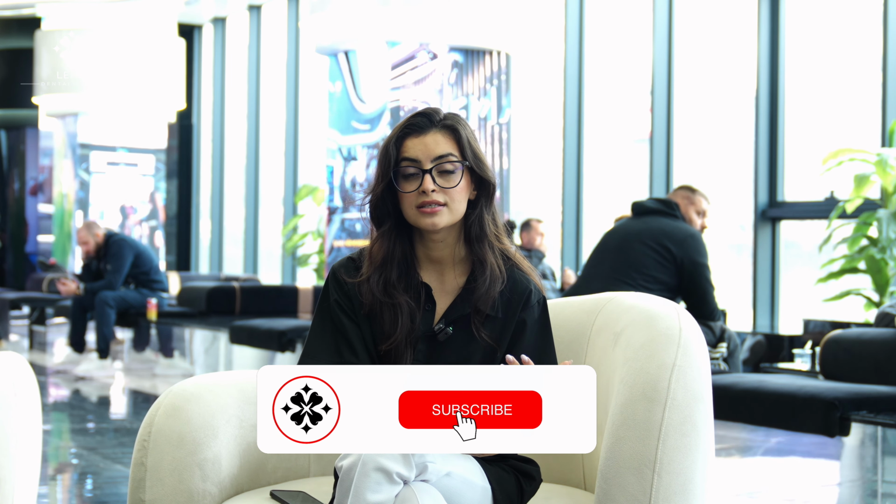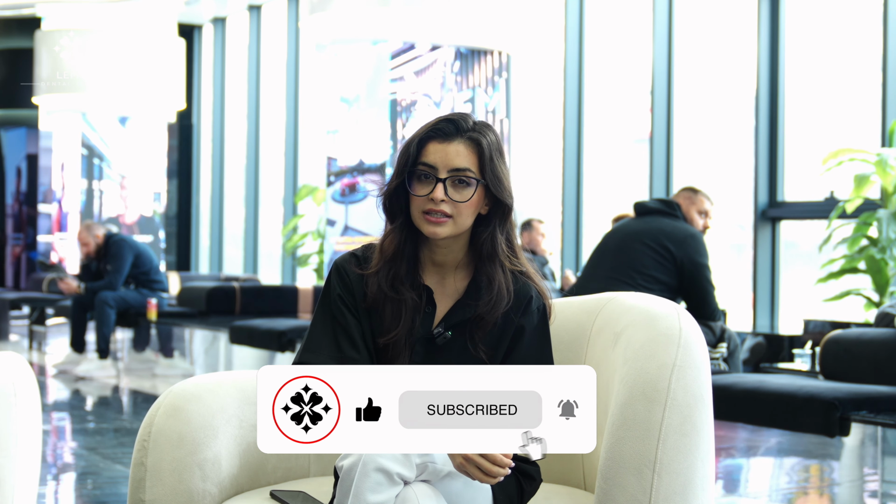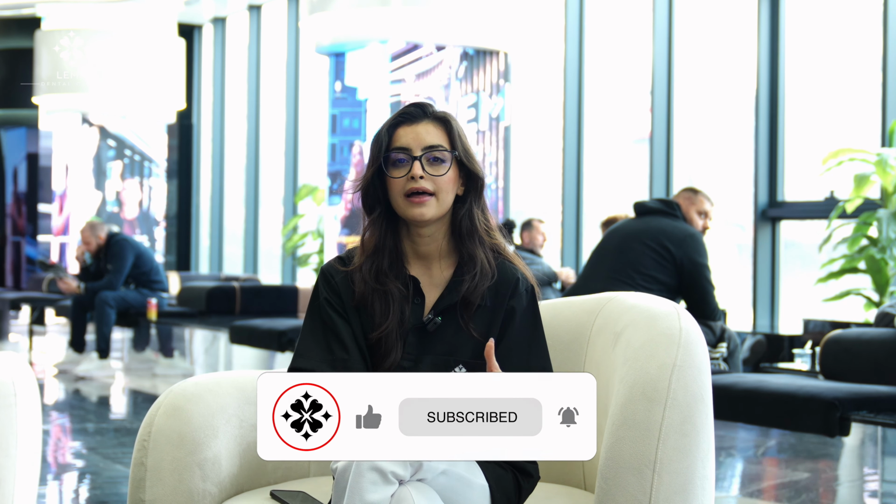X-rays during the root canal procedure. Throughout the root canal procedure, additional X-rays may be taken to ensure the dentist has thoroughly cleaned and shaped the root canals. X-rays allow the dentist to verify that all the infected tissues have been removed and that the canals are properly prepared and sealed. This real-time feedback is essential for the success of the treatment and ensures that the infection is completely eradicated.